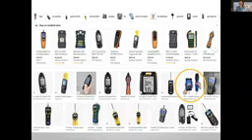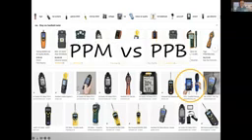Now, rather than doing mass spec and gas chromatography, can we measure VOCs in the lab? Well, the problem is that the sensitivity really is on the parts per million level and not in the parts per billion level. All these handhelds are really nice, I think, but I haven't seen tests being performed to compare these models for IVF laboratories. They usually measure in parts per million. An example is this one here from the Grey Wolf company. This is a more expensive unit, and it measures in parts per billion.